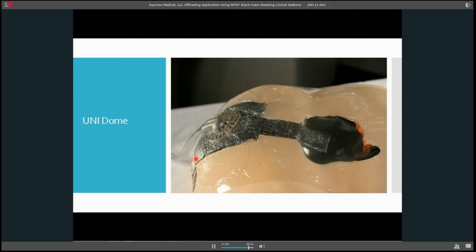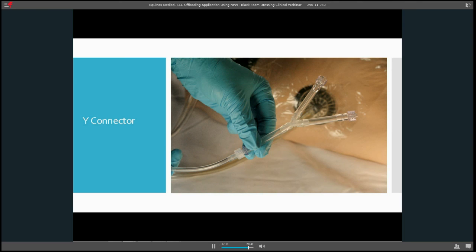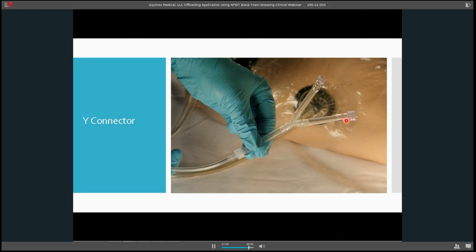So here you can see we've now hooked it up to our negative pressure and it's compressed. It looks a little funny here because the picture was taken on an angle. But everything has compressed down like a raisin, as you can see. The tubing will then be anchored down.